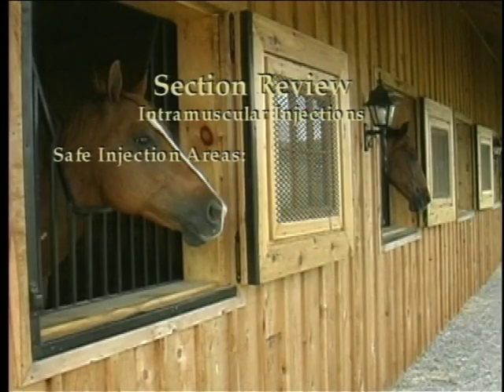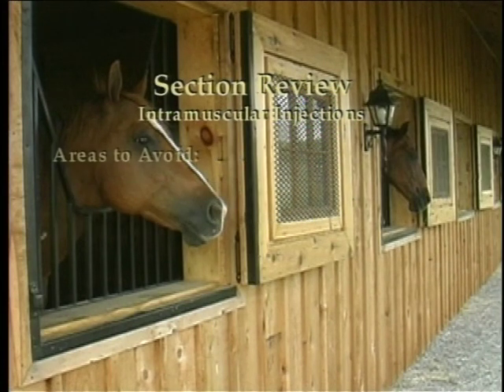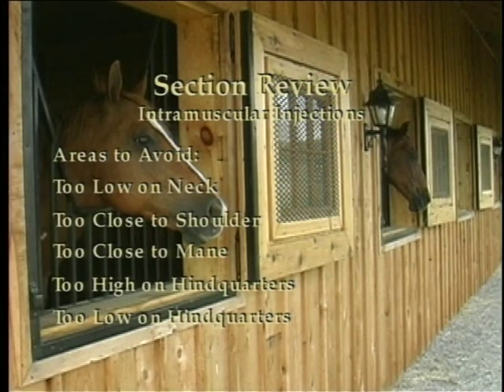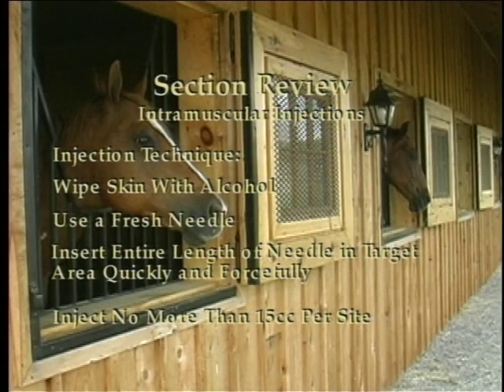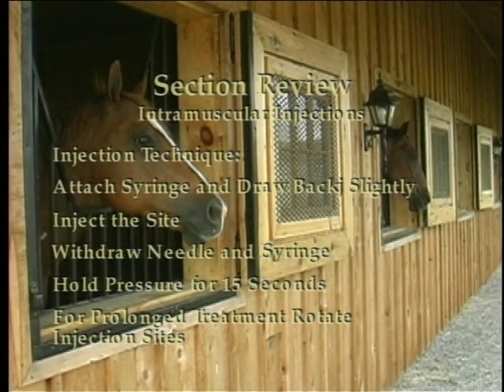Summary of intramuscular injection guidelines: Safe areas are right and left neck, right and left hindquarters. Areas to avoid are too low on the neck, too close to the shoulder, too close to the mane, too high on the hindquarter, and too low on the hindquarters. When giving an intramuscular injection: wipe the skin with alcohol, use a fresh needle, insert the entire length of the needle in the target area quickly and forcefully, inject no more than 15 cc's per site, attach the syringe and draw back slightly, inject the site, withdraw the needle and syringe, and hold pressure for 15 seconds. For prolonged treatment, rotate injection sites.